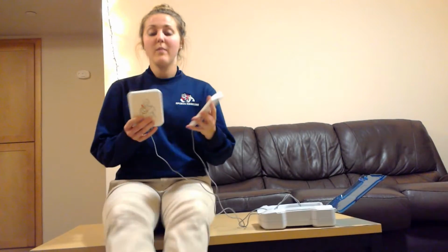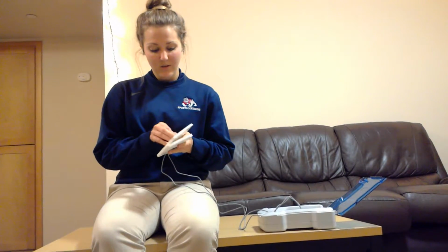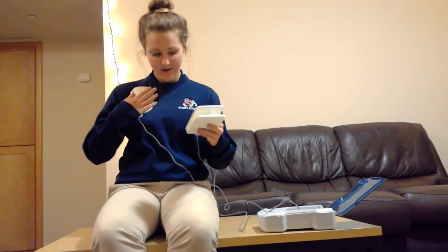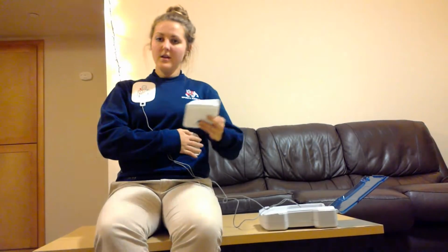So I would cut the shirt or the clothing, whatever they're wearing, and I would make sure that the area was clear. Next, I would place the pads on the body. They are labeled to where the pads need to go. So the first one would go the upper right quadrant right here, and then the second one would come lower left, right below.